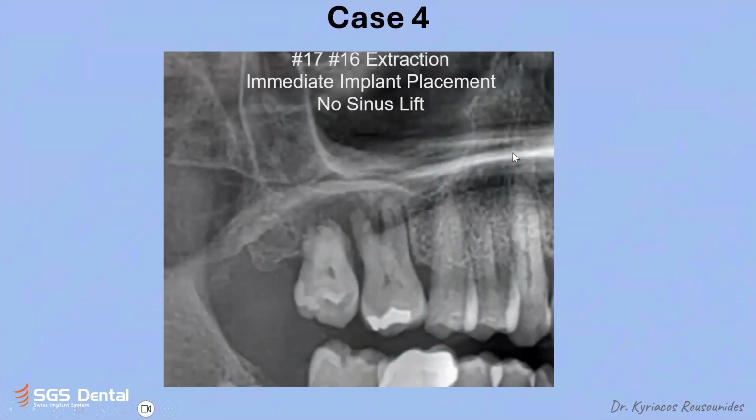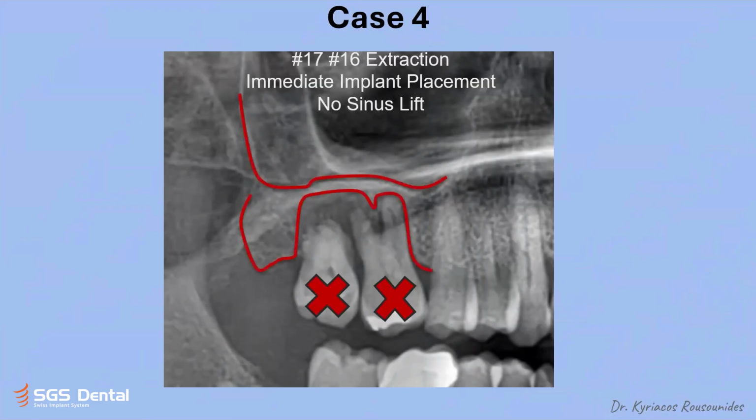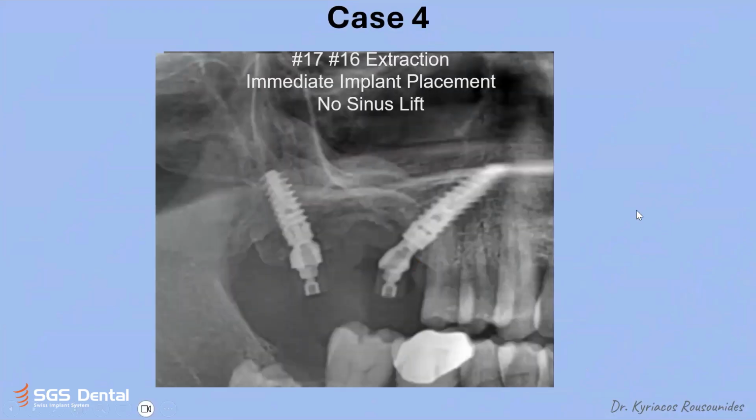Here, the X-rays are one above the other, and the lines are the same. And this is how the two implants were inserted without any sinus lifting here, without any augmentation in this area. I trust more these two implants instead of two implants in a fully augmented region.